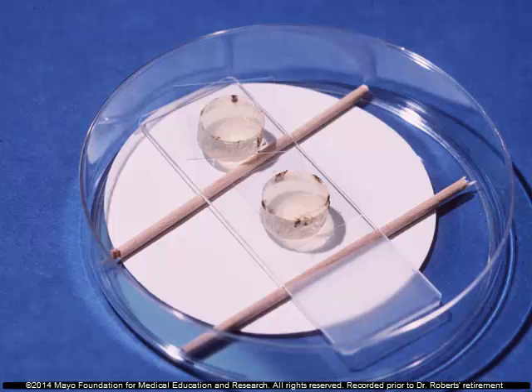This is the cheap way to do it. It works well. You take a piece of filter paper, put it in a sterile petri dish, break a sterile applicator stick in two, and then put the slide on there with a couple of agar plugs and inoculate it. Put a cover slip on top and let it grow. And you put some water in the bottom so that there's enough humidity in there, and that filter paper will absorb the water.